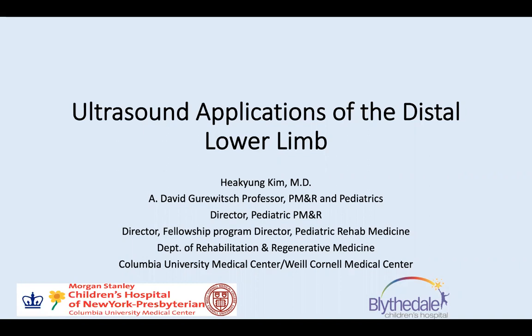This is for lower limb, especially the distal part of the lower limb. Ultrasound application part 2. We reviewed the upper limb, lower limb proximal part, and head and neck earlier. So this will be the ultrasound application of the distal lower limb.